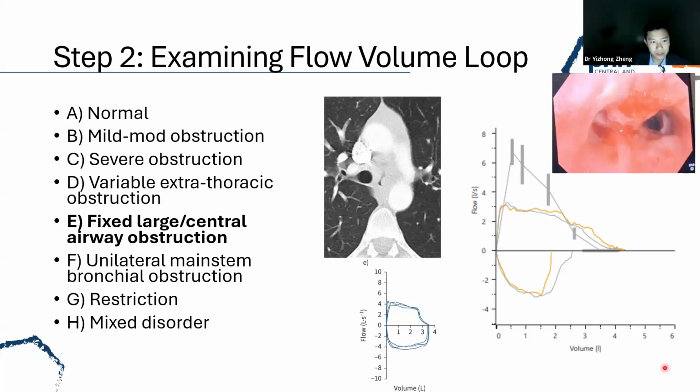So going back to our original case, a reminder, this is what her flow volume loop looked like. This was a 45-year-old female with a smoking history who hasn't responded to bronchodilators and steroids, with an obstructive ratio, but their obstruction with a reduced peak flow is due to a bronchus and tracheal lesion. So she had a left main bronchus lesion and partial obstruction of the right, giving this plateau appearance on her flow volume curve.